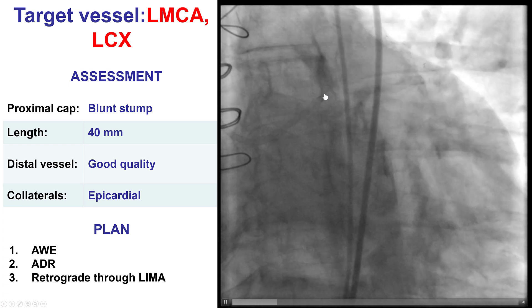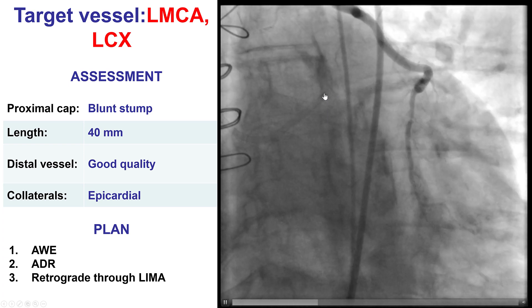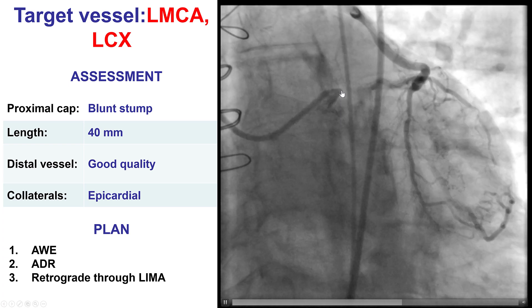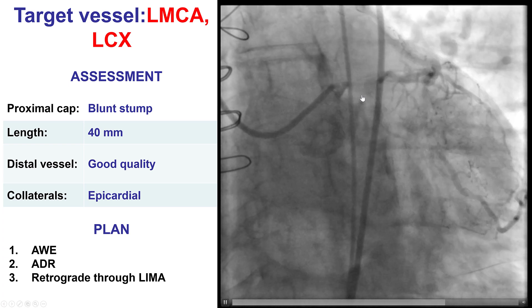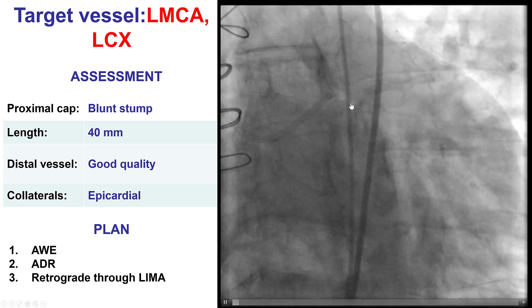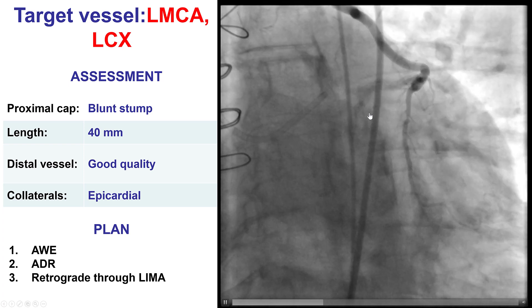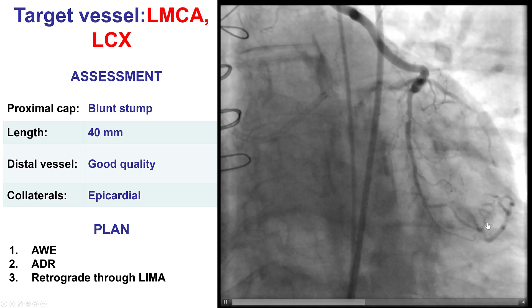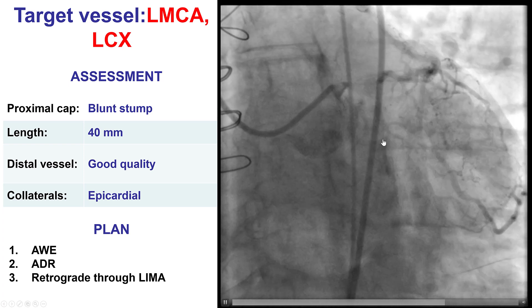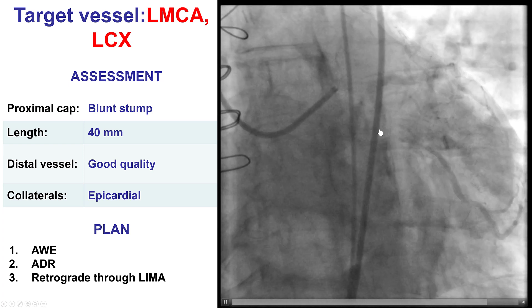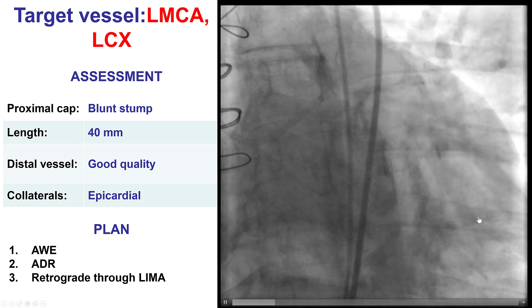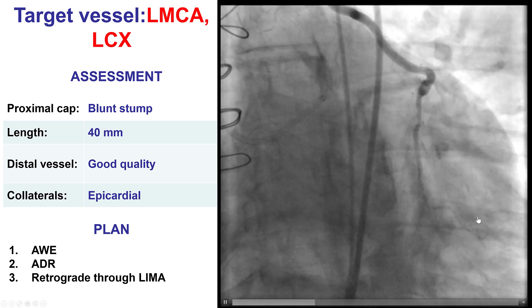The left main had a blunt proximal cap. There was severe calcification. The length was about 30-40 mm. Distal vessel was of good quality. And the collaterals were mainly epicardial and were not interventional.